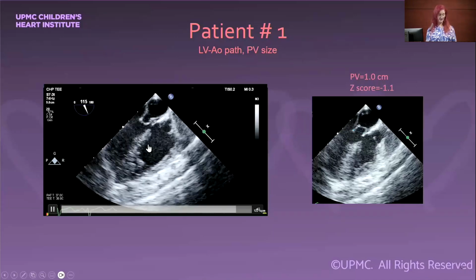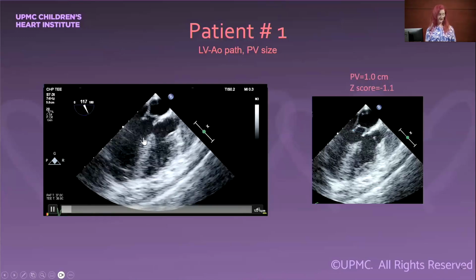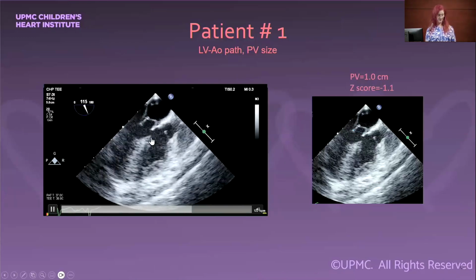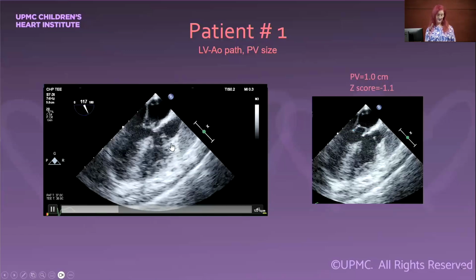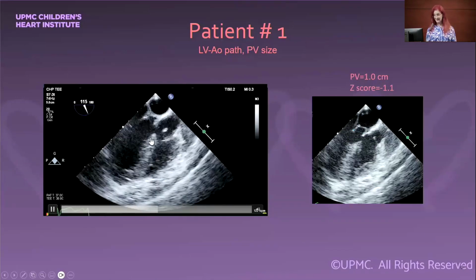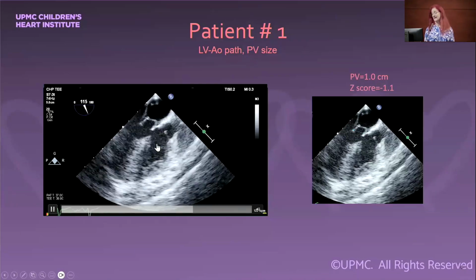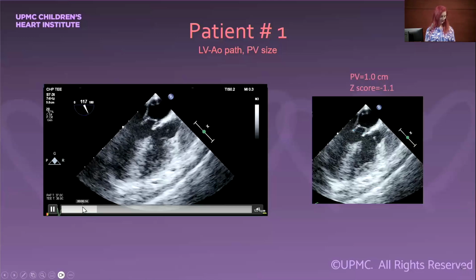And here is the septum. As you follow it up, there is the VSD. So definitely an outlet VSD, but when you start to draw your path this way, certainly the aortic valve is close, but it's not very wide. I would not want my systemic output to go across that hole.